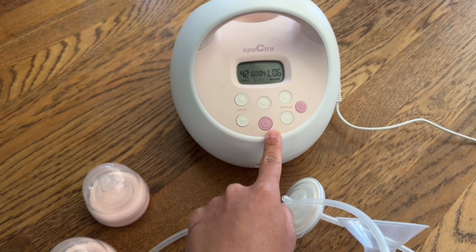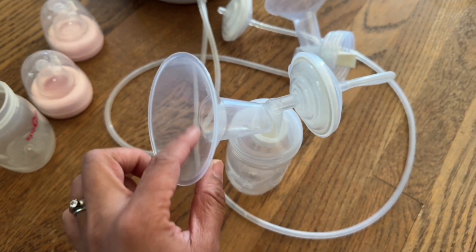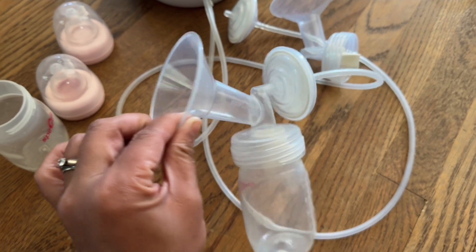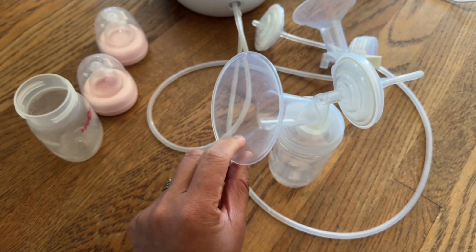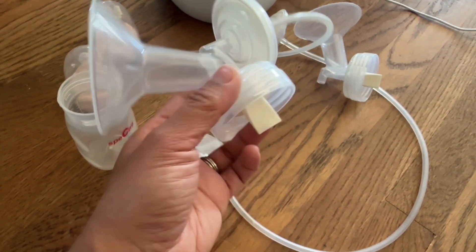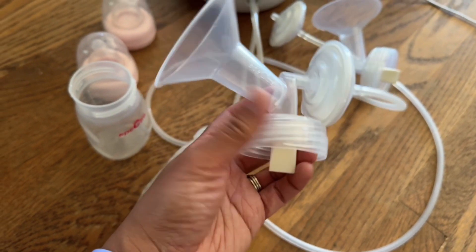What works for someone else may not work for you, so you have to play around with which setting works great for you. You might have to get a different flange depending on the size of your nipple, because not everyone's is the same. The valves are also replaceable — once you keep pumping, they will wear out and you have to replace them.